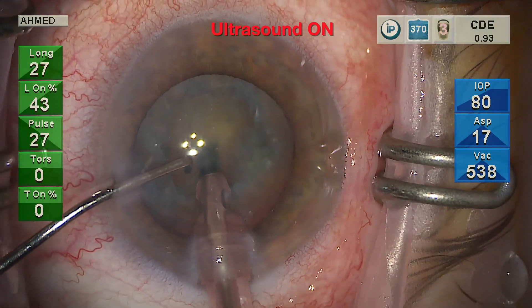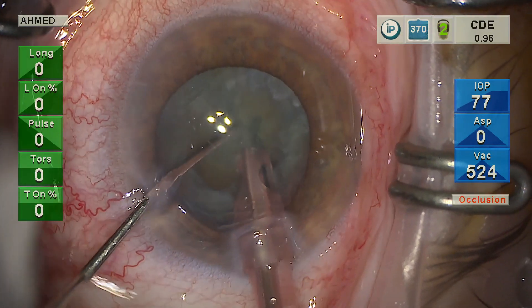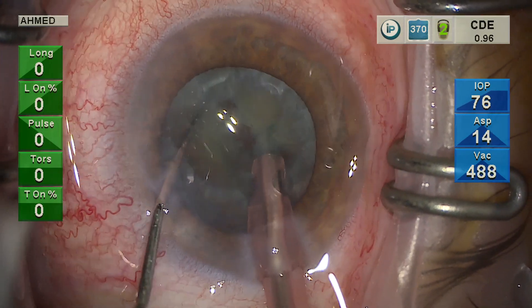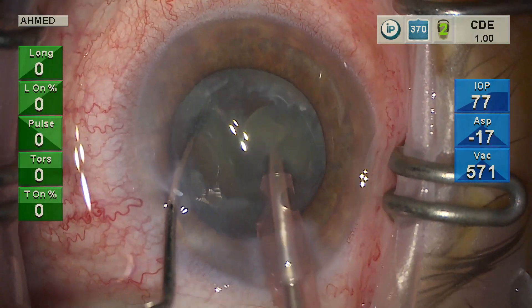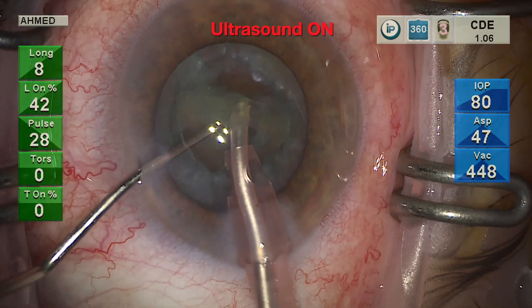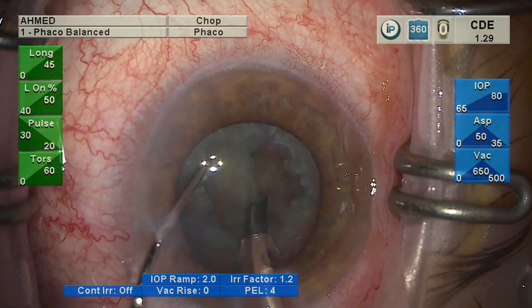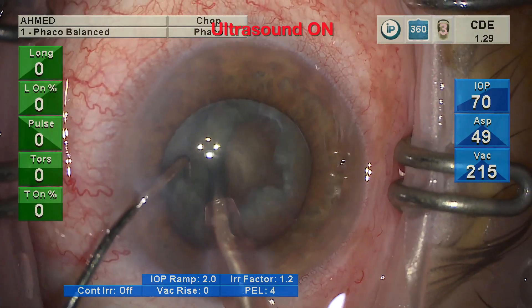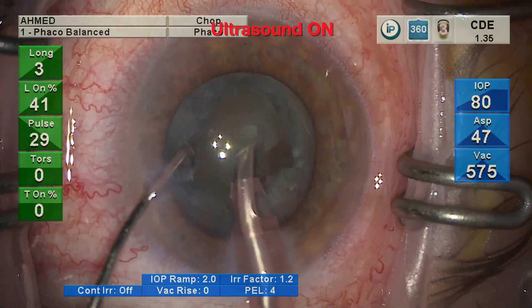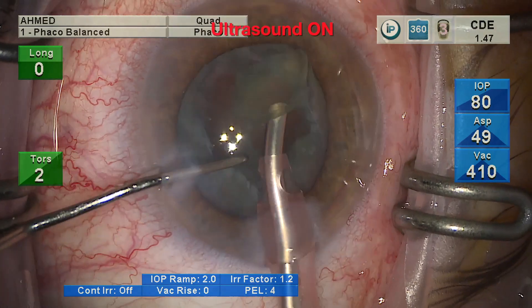When we look inside the eye, this is a 2.2 millimeter incision with a soft silicone sleeve using longitudinal phacoemulsification. During the procedure, we see no actual droplets on the surface of the sleeve. There is some fluid around the eye that we can see, however from the actual phacoemulsification portion — as opposed to the irrigation or aspiration portion — we don't really see the formation of these water beads or this mist formation.